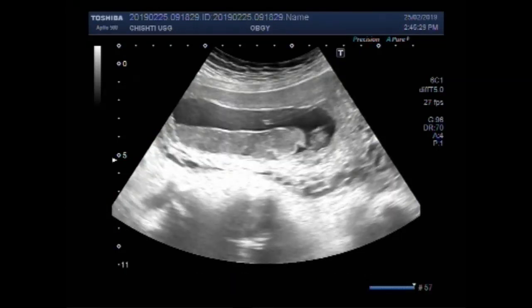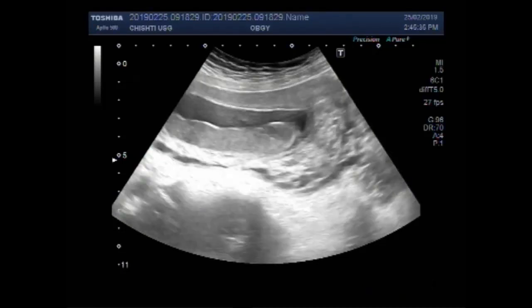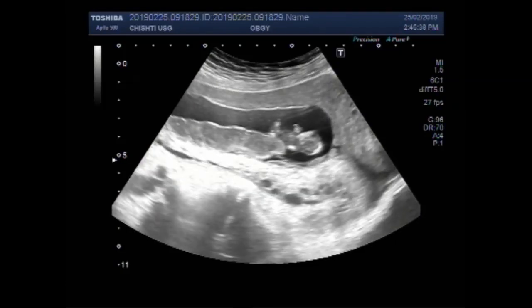The gestational age measures about 10 weeks, 5 days. This is the placenta — it is posteriorly attached.